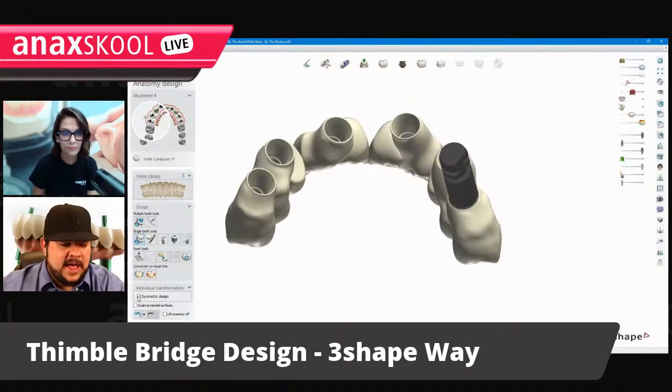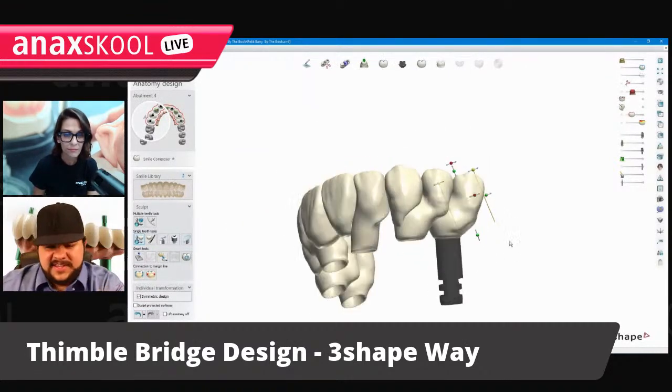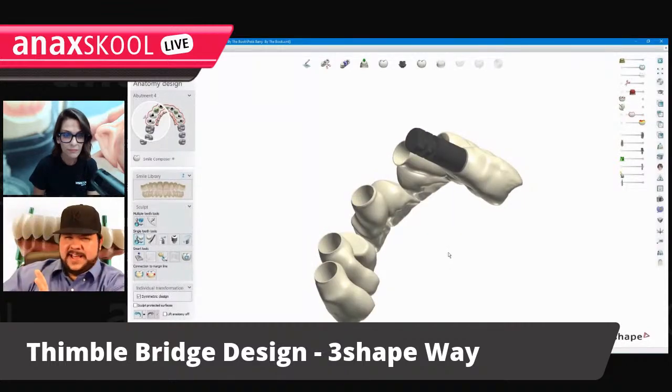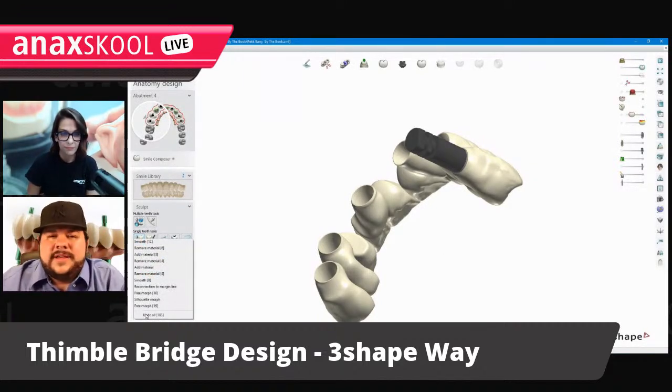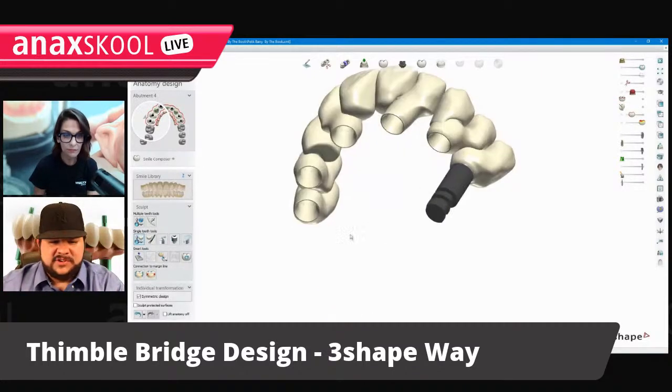That's just a pain. How many operations did I spend going from a finished design diagnostic to this step where I had to move everything over and get them close to the implants with the morphing tools to connect? And that was down here, 103 operations, 103 clicks, just to get everything tuned. So we're gonna skip that next time because that's just a huge waste of time.